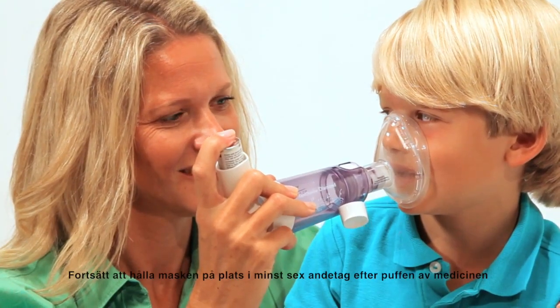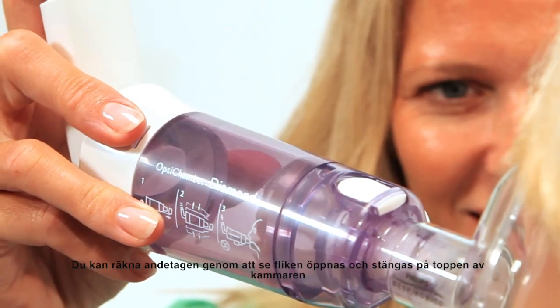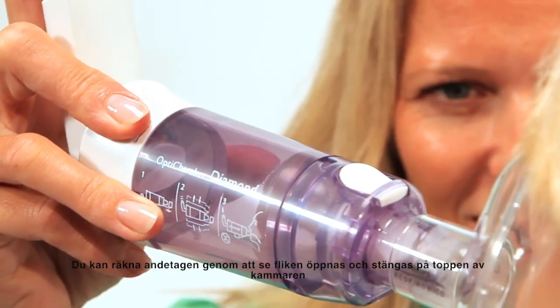Continue to hold the mask in place for at least six breaths after spraying the medication. You can count breaths by watching the flap open and close on the exhaust valve on top of the chamber.